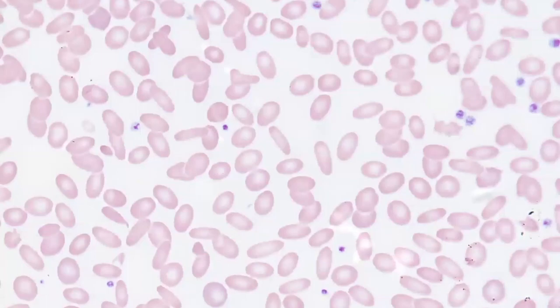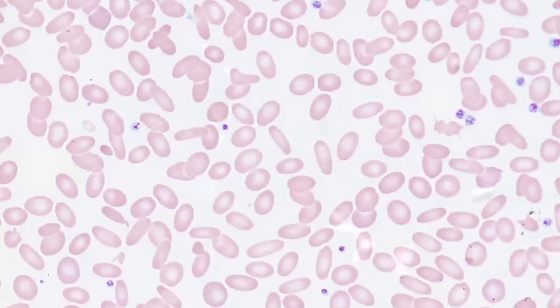Hereditary elliptocytosis also shows an autosomal dominant inheritance pattern. Typically, the elliptocytes will make up 70 to 100% of the red cells, but even in some cases, the elliptocytes may represent only 25% of all red cells. Since hereditary elliptocytosis is often asymptomatic, the diagnosis is frequently made incidentally. A mild degree of red cell fragmentation due to the red cell shape may lead to a mild anemia in some cases.